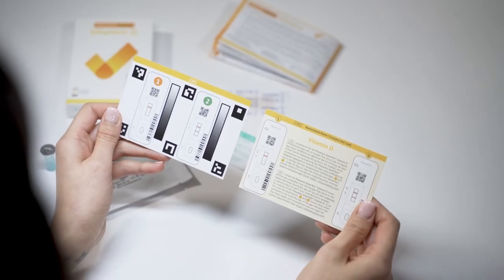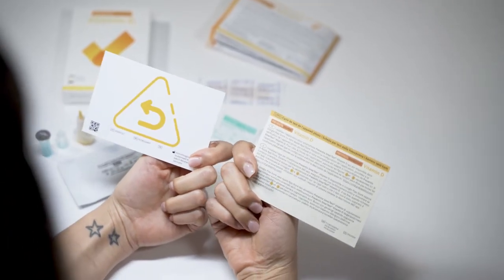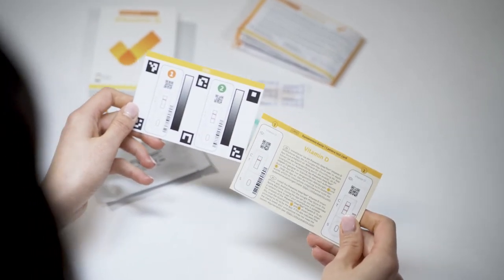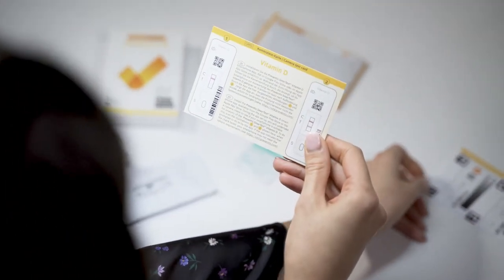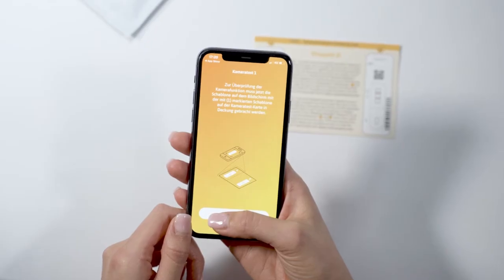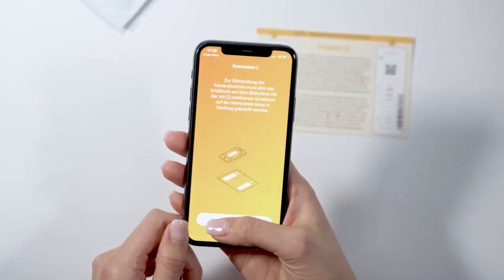There are two different versions of the camera test card. Both are labeled 'card' and work identically. There is only one camera test card in each package. Place the camera test card on a flat, light-colored surface so that the yellow bar is facing up.